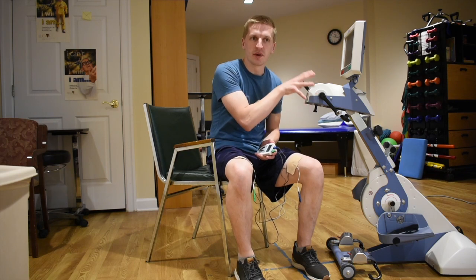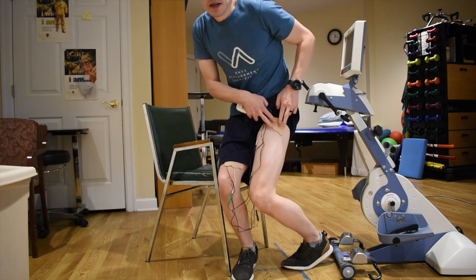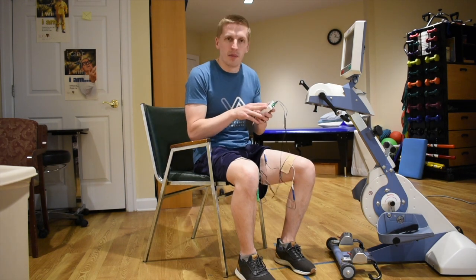In this second part of the video, I'll show you using the PENS electrical stimulation with the Omni Cycle. You want to get your pads set up on both legs for your quadricep muscles — the distal and medial quadriceps as well as the proximal and lateral quadriceps on both sides. Once that's done, connect it to the wires of the Omni Stim unit and, with the help of your therapist, set the appropriate frequency or revolutions per minute for your goal.